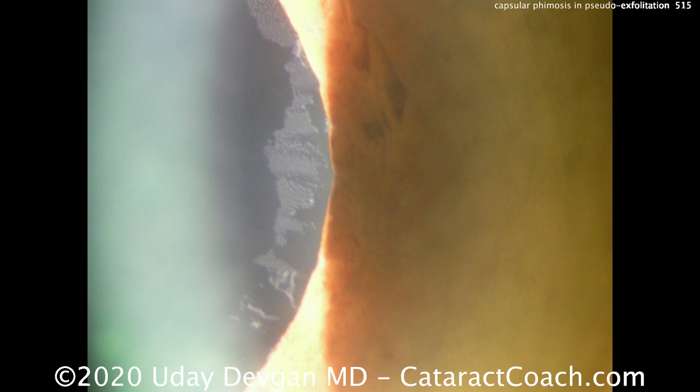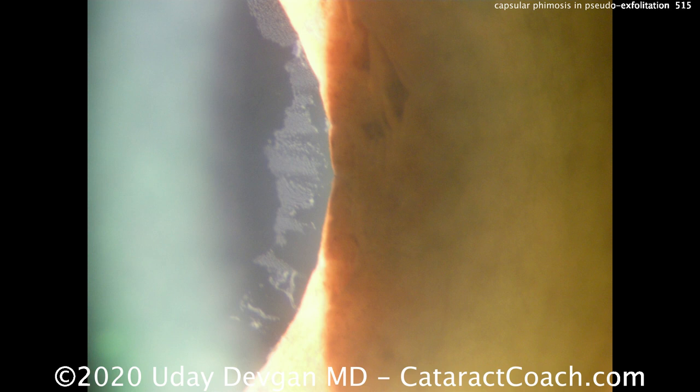Here's another picture of that same eye — the cataractous eye. You can see there's an extensive amount of pseudoexfoliation material. How is that going to make the surgery difficult?